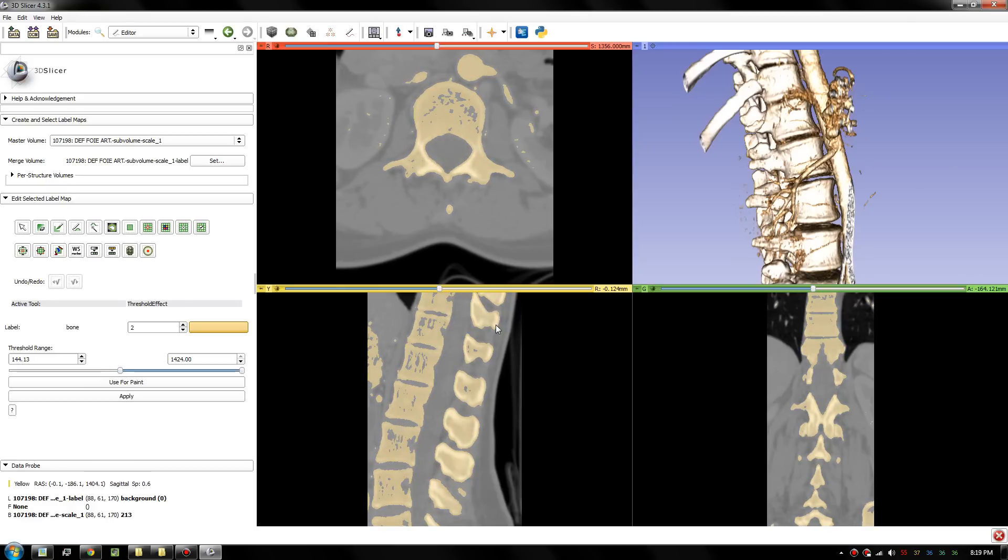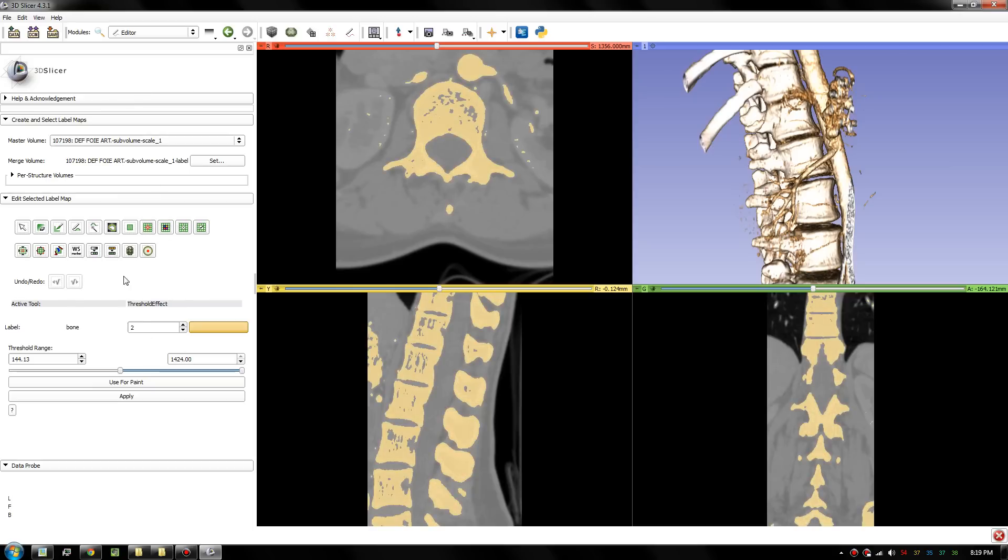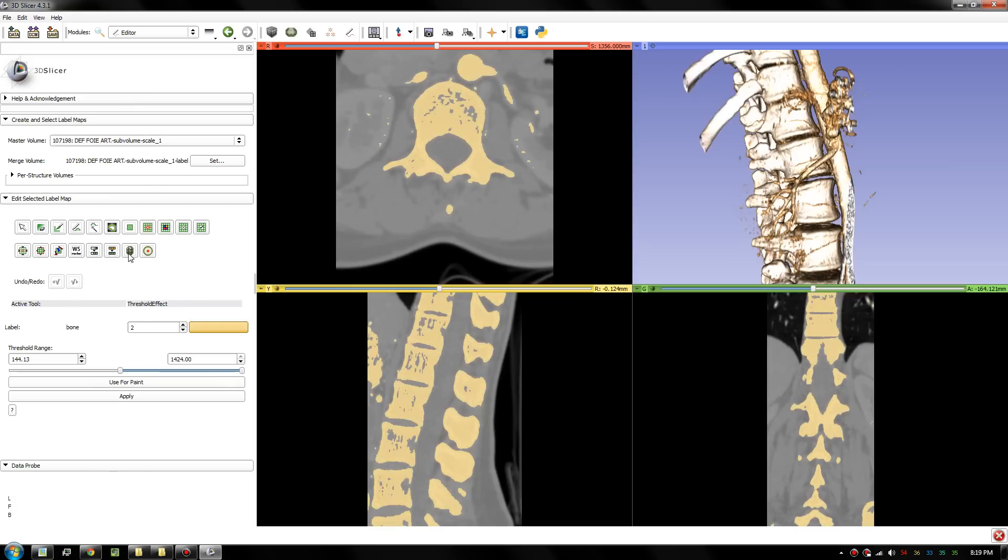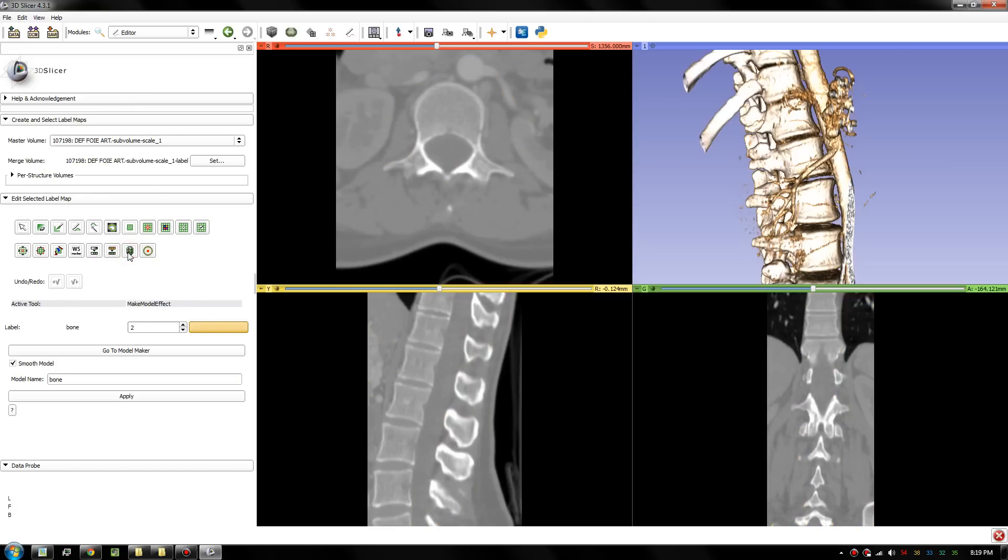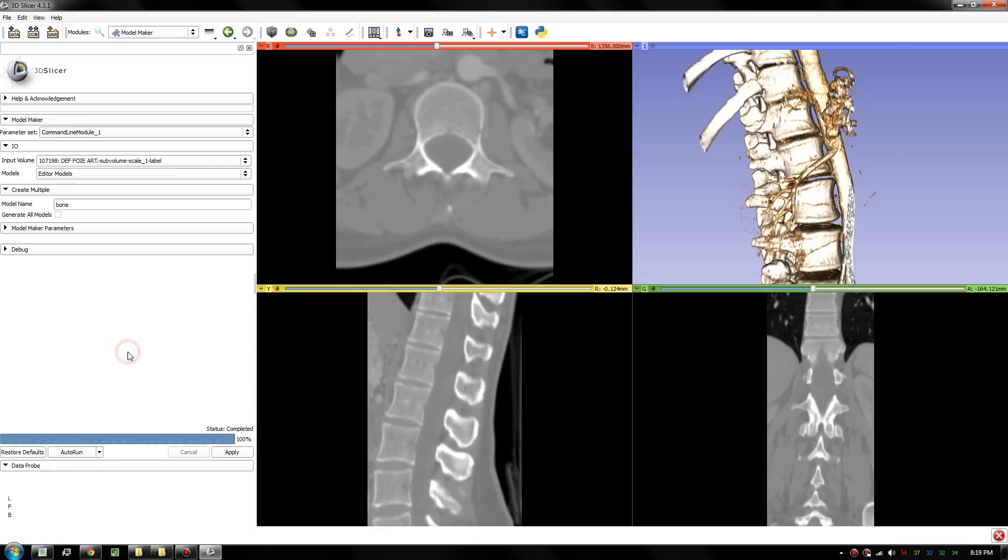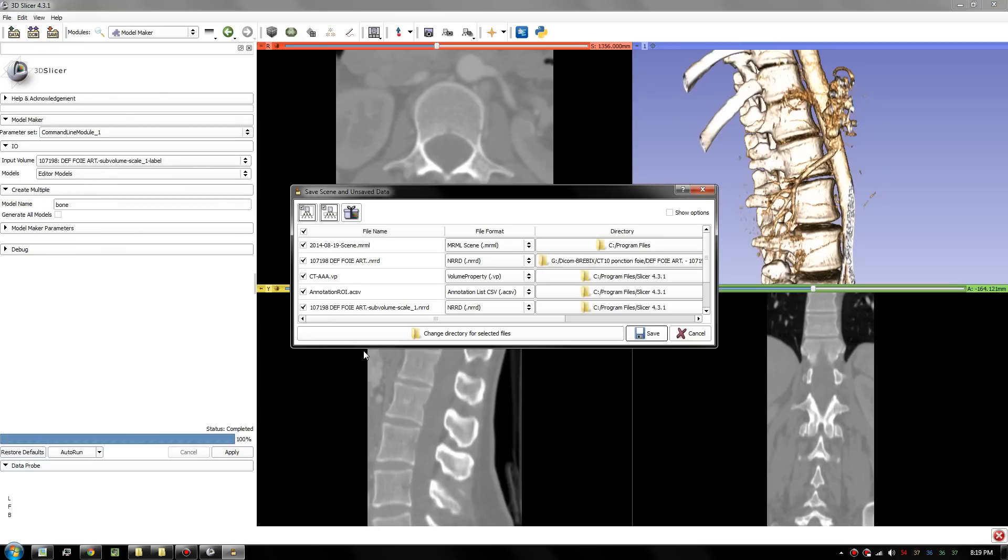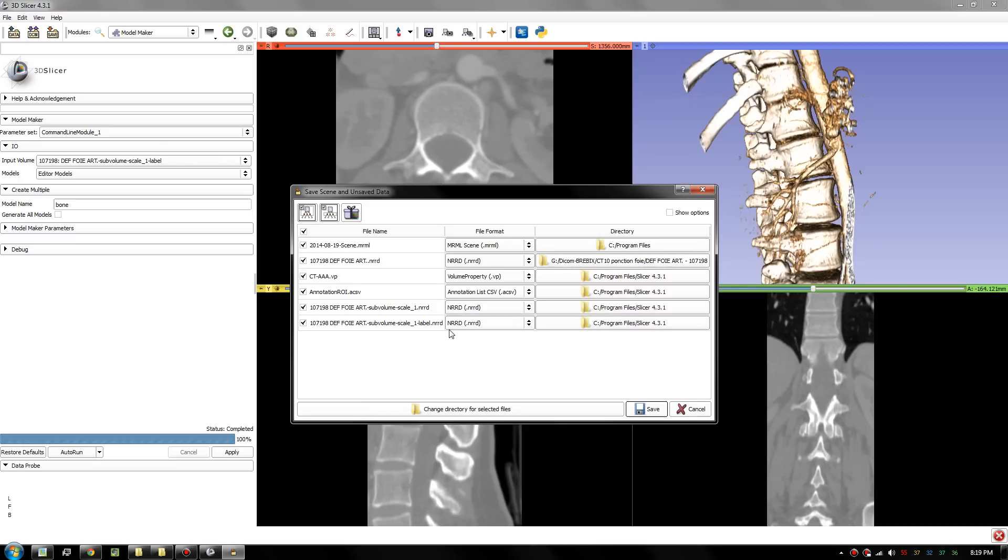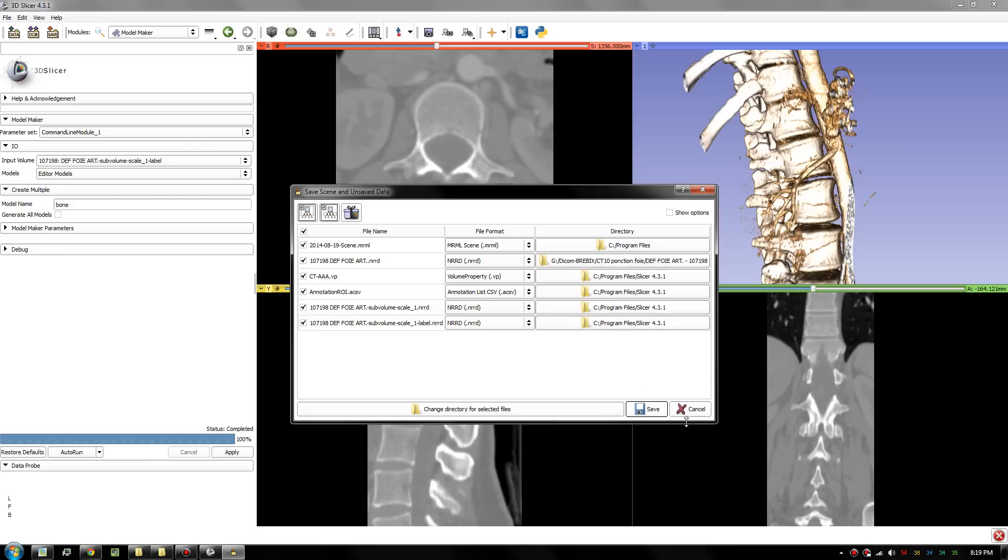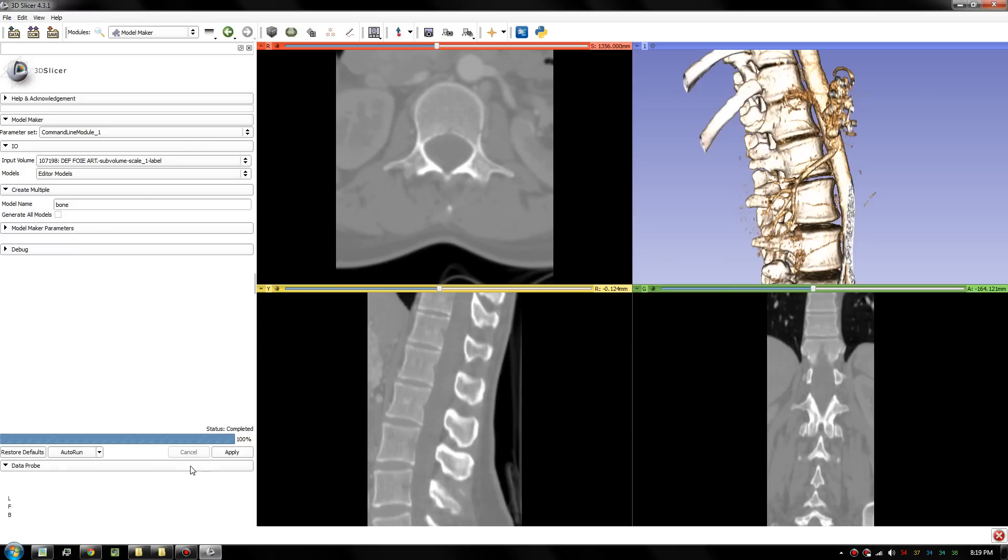Once you do that, to generate a 3D model, we simply click here, make model. Click apply and it will start to generate the model. We can go to model maker to see the program generating that. Once you're done, we can go save. It's not showing up. So it should be a bone material here.